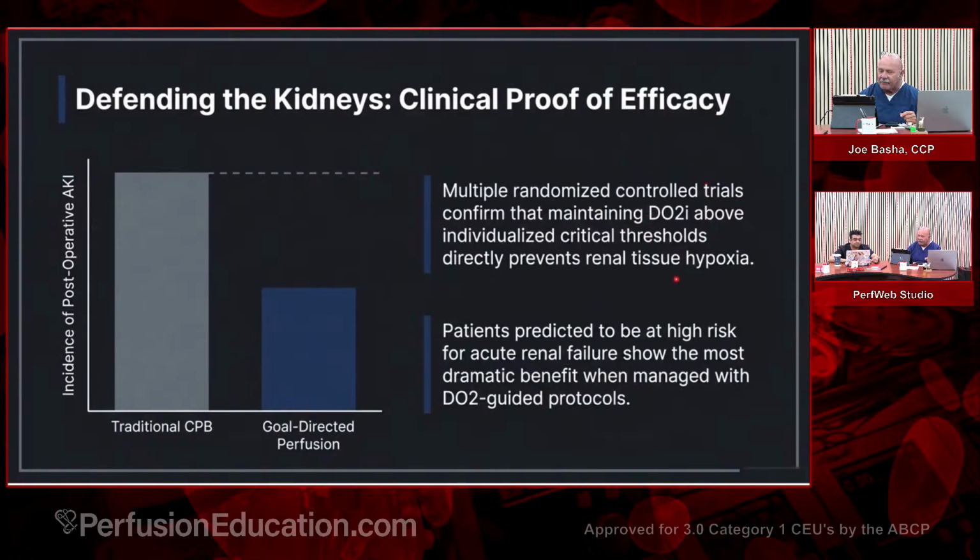I think that we have historically been under-perfusing a lot of patients prior to this new concept of DO2I being something we normally look at on a daily basis. I mean, 20 years ago, I didn't even think about it. Right. It wasn't even, like, am I flowing enough? I think so. Yeah, it never even got consideration. So this is kind of new, a new technique that I think has been beneficial for us as perfusionists.